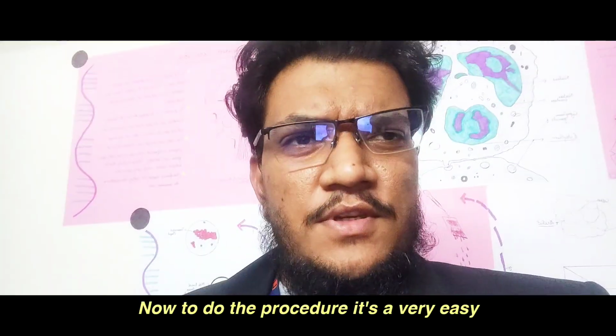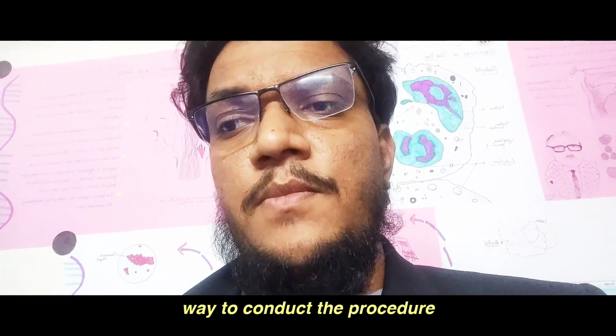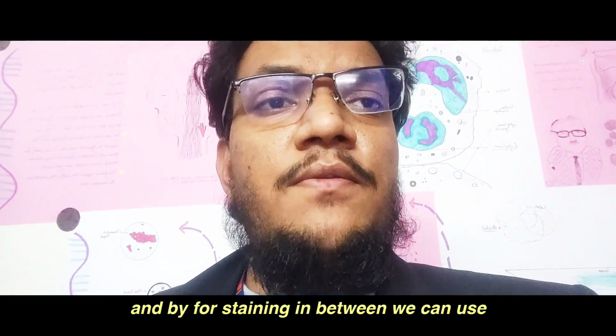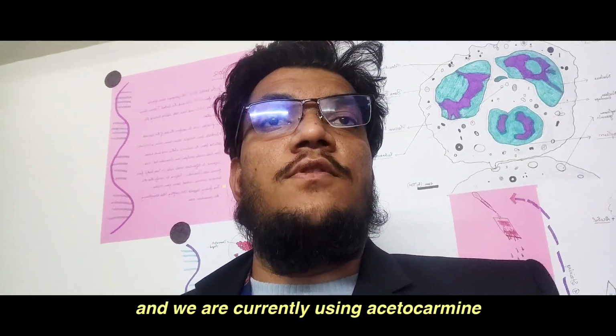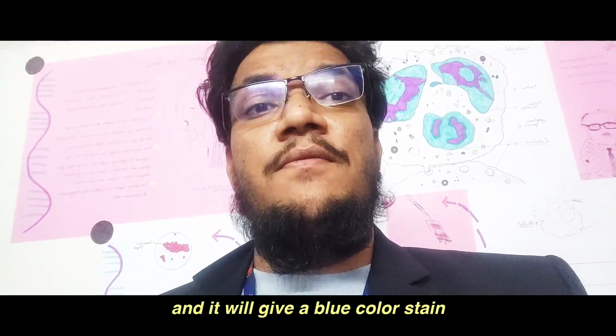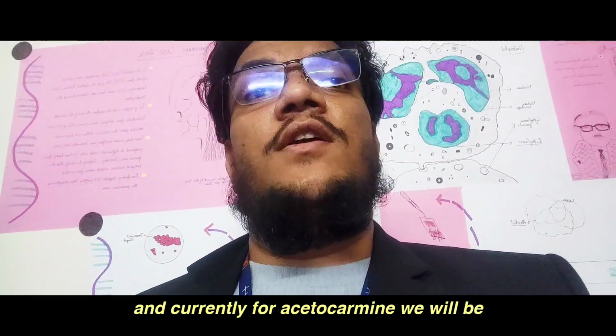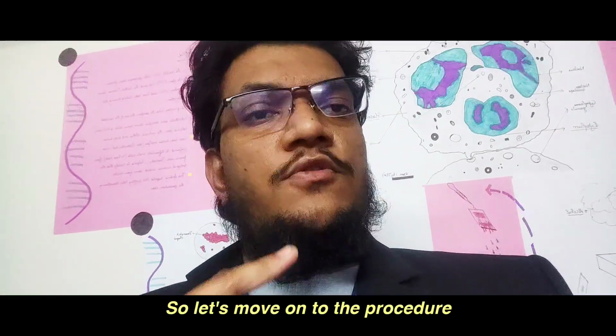Now to do the procedure, it's a very easy way to conduct the procedure, and for staining in between we can use the methylene blue as well. We are currently using acetocarmine, but if methylene blue is available we can use it and it will give a blue color stain, and currently for acetocarmine we will be getting a red colored stain. So let's move on to the procedure.